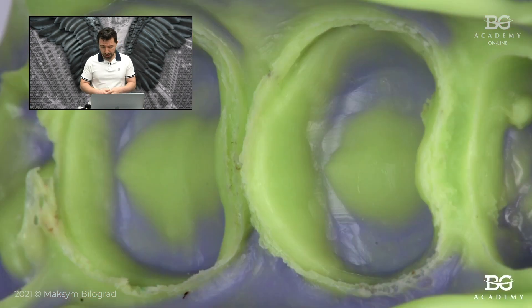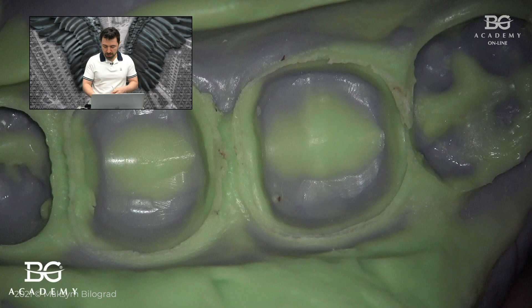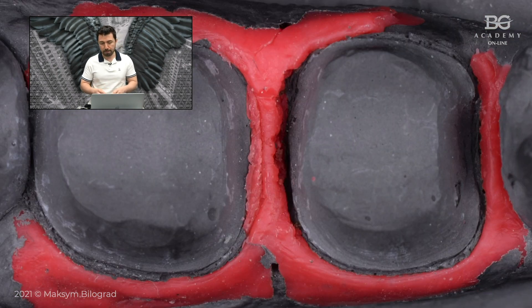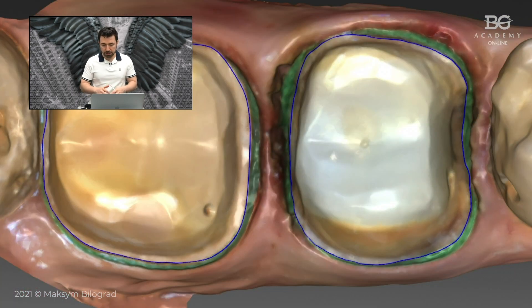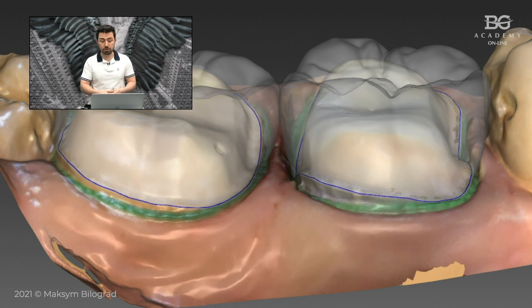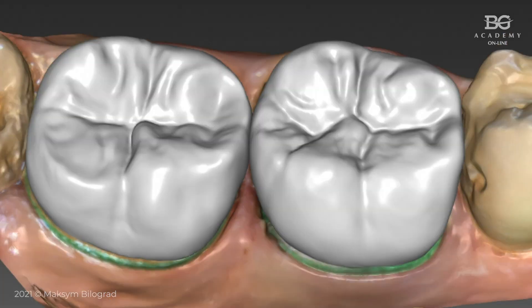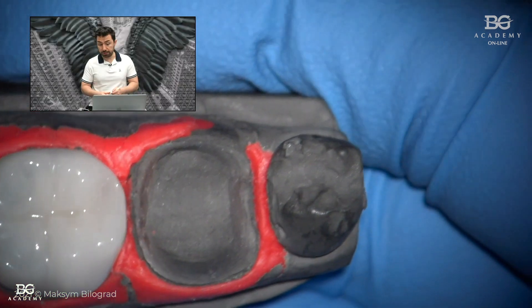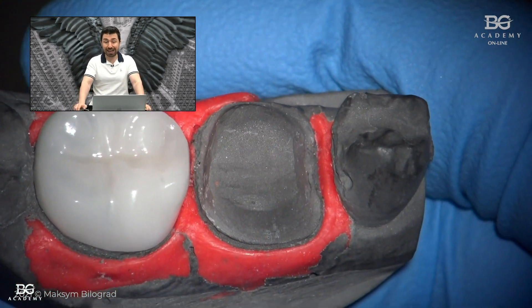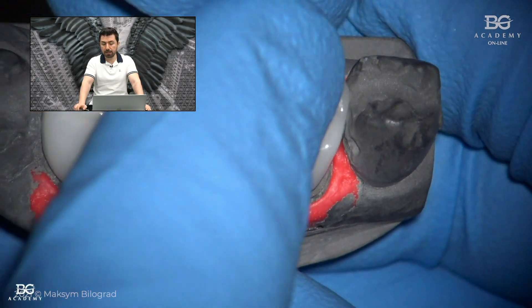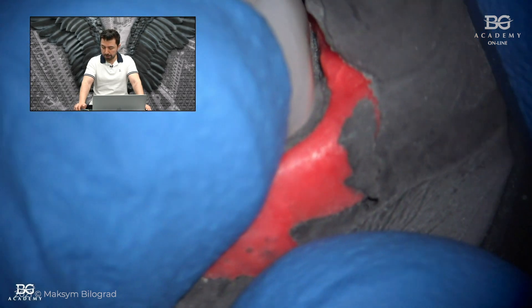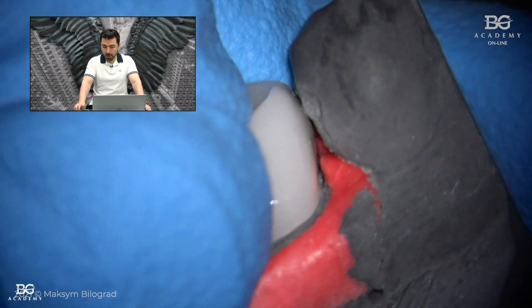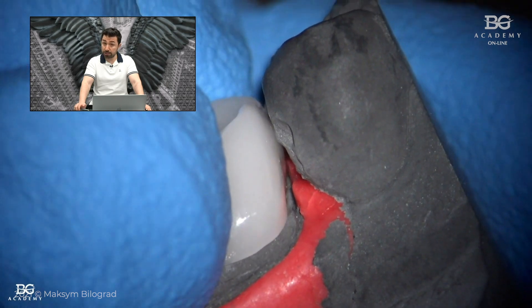Next, we made the impression and then a cast control model. Let me show you the cast model. This is the part from the dental lab — here you can see the design of the Emax crowns. We have full contour Emax crowns, and here you can see the crowns on the control model. I filmed a video of the dry-fit control on the plaster cast model. You can see the exposed margins, and with high magnification — this video was filmed from the microscope — you can see how a crown fits to pretty deep margins.